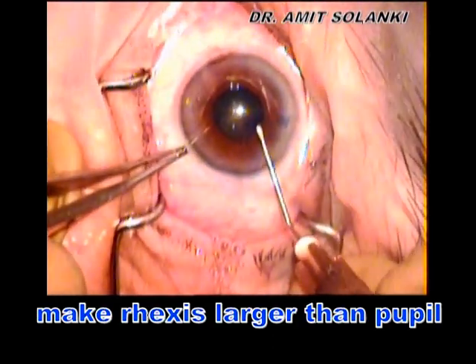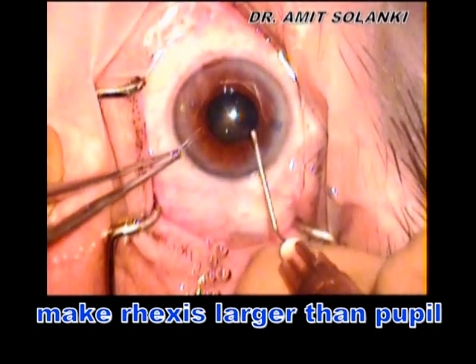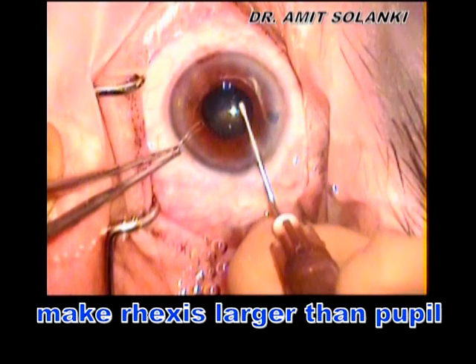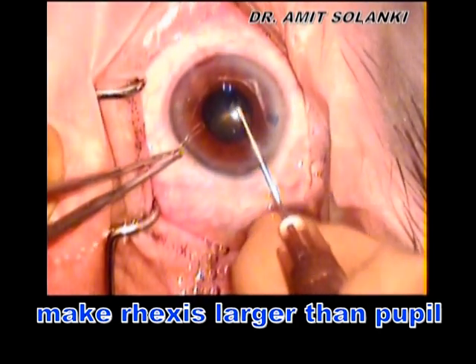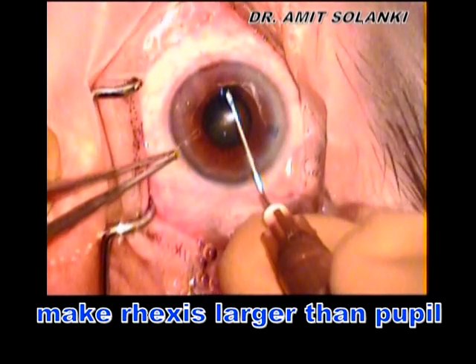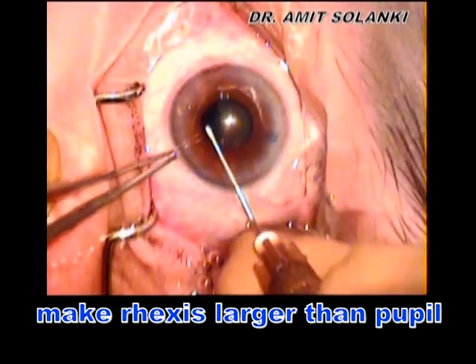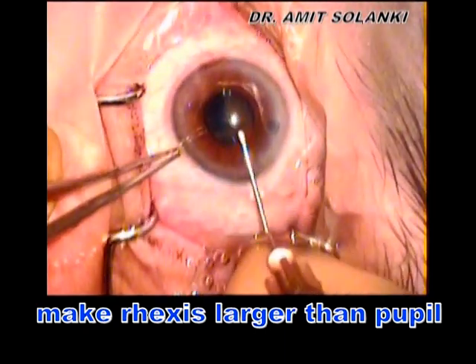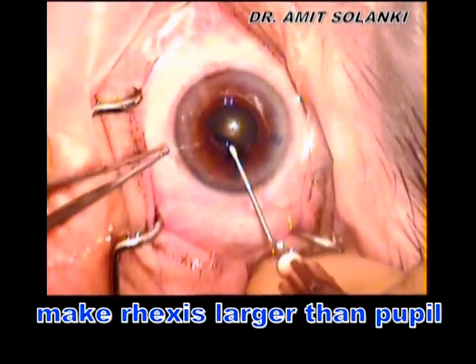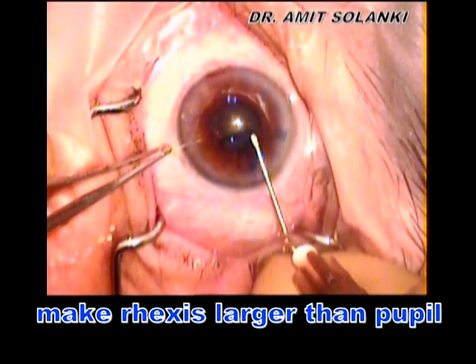To achieve a larger rhexis, make sure that the leading edge of the rhexis extends beyond the pupil margin under the iris. But this requires better control, or else it will be blindly extended. So stay in the capsule, inject viscoelastic intermittently, and one may actually lift the iris with a Sinski hook to observe the position of the rhexis and achieve better control.